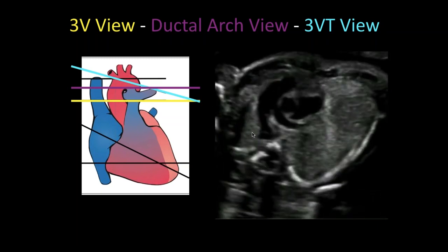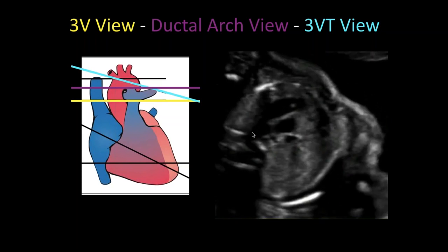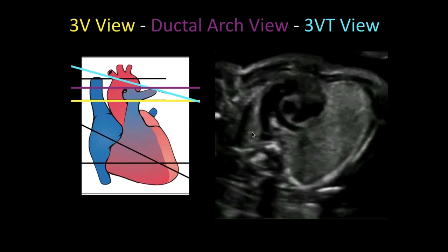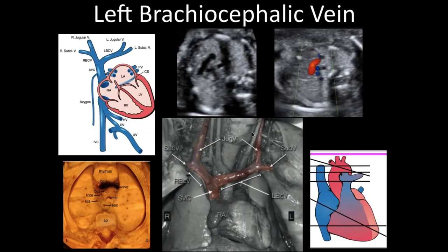My advice to you is to really practice on every patient that you scan, looking at cardiac anatomy and how to get those views, so you become very comfortable in obtaining them.